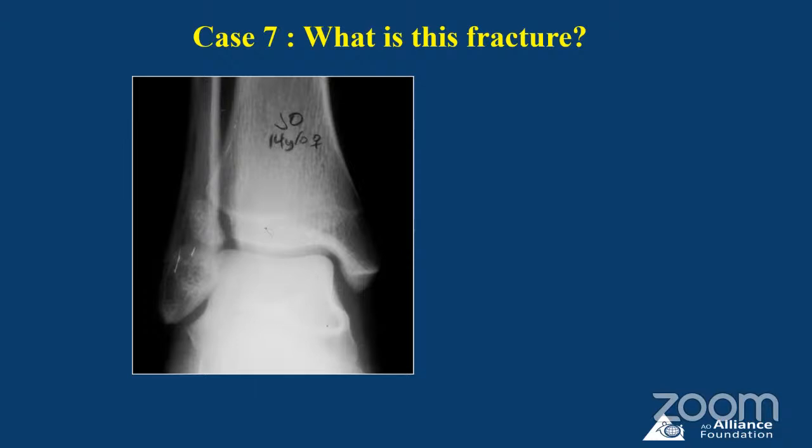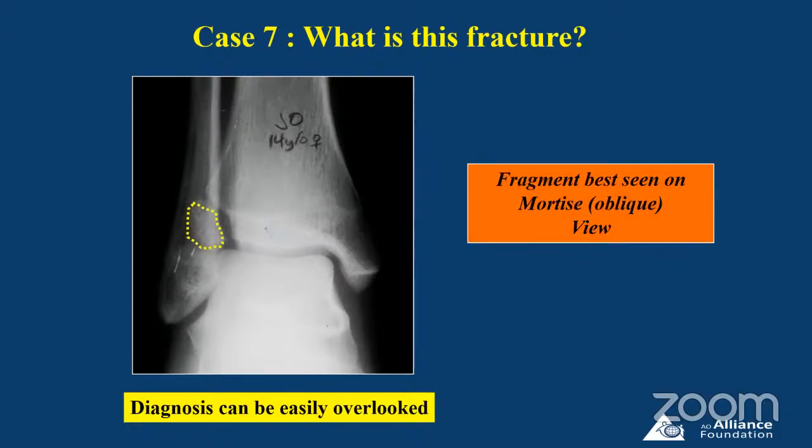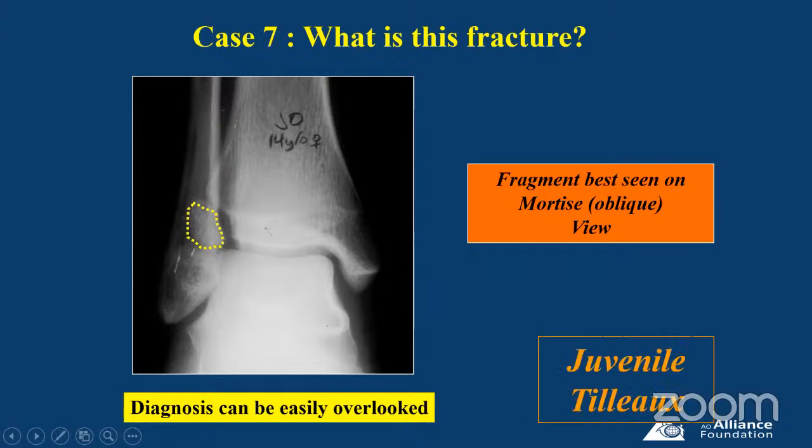Now there are two special intra-articular fracture patterns in adolescents. Now this particular fracture is commonly missed. Look at this x-ray carefully. You might think this is normal because a mortise view has not been taken. This can be easily missed. And what you see here is a Tillaux fracture. Now this is a distal tibiofibular ligamentous avulsion fracture. This is an intra-articular fracture. And unless you take a mortise view, you will miss it.